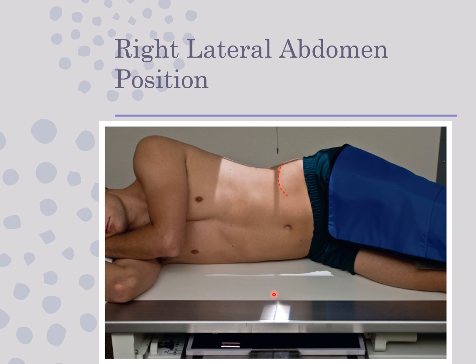So, because this is not just a supine abdomen, the central ray, literally for every other image we do of the abdomen, besides an AP supine, so AP supine is different, but every other image, the central ray, if you're able to do it on one image receptor, should be 2 inches above the iliac crest at midline. Okay, if you can write that somewhere and commit that to memory, it's huge.